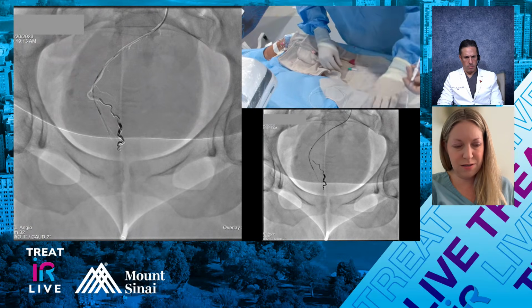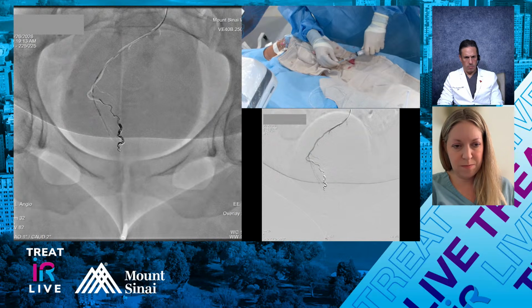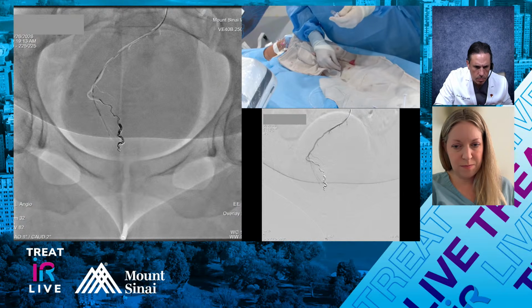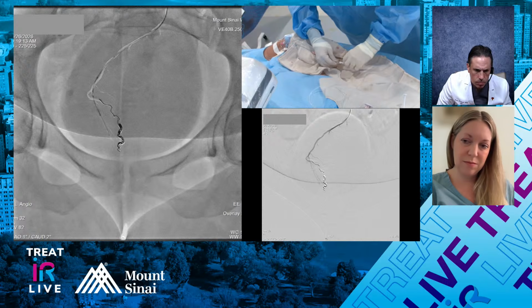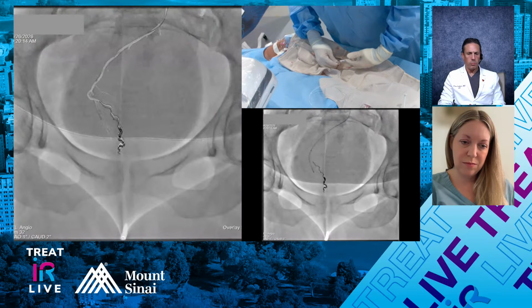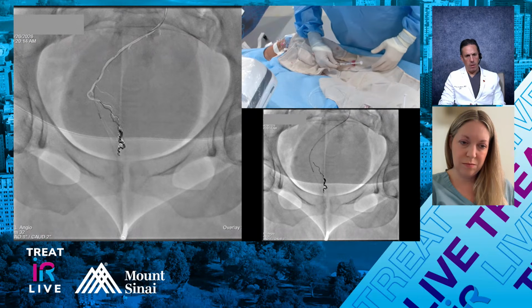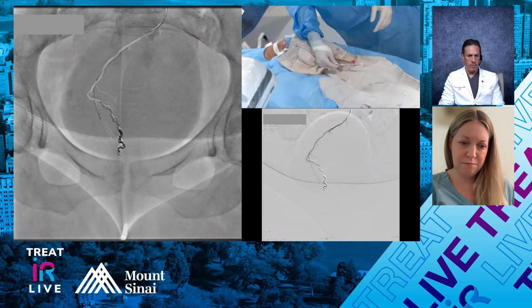To what everybody was saying, we have an idea of what we're seeing, we're going to go in, but even after we embolize, it has to be on a minute by minute basis as things open up, as things appear more prominent, as things actively collateralize while you're doing the case. We have 2/8 here too, right? It looks like you got into the origin pretty easily, and the catheter's tracking fine.